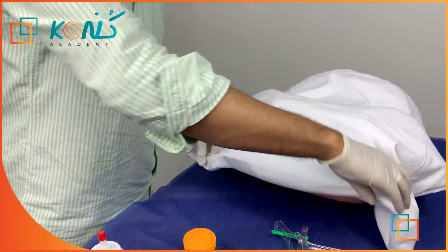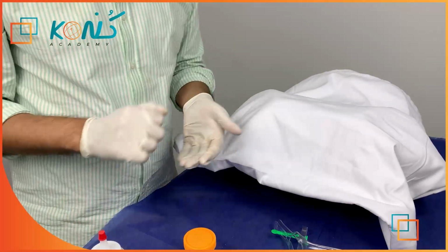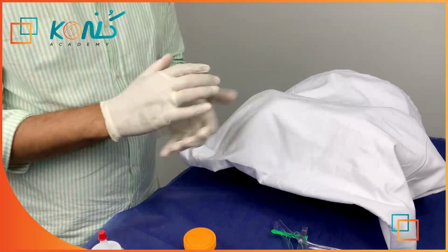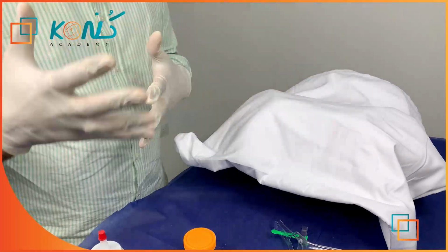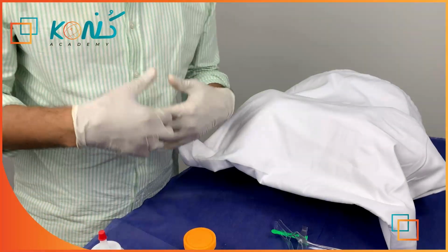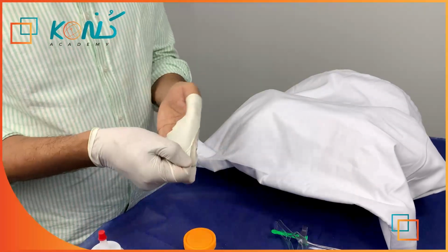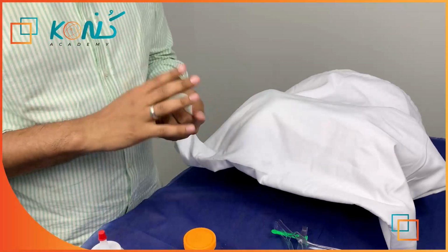You can let her know that she can experience some bleeding after this speculum examination, and you will label the sample of your patient and then discuss with her the waiting time for her sample, nearly an average of 2 to 4 weeks. Sometimes it takes 3 weeks to get back, or a maximum of 4 weeks. Then you will take off your gloves, go and wash your hands again, and thank your examiner.